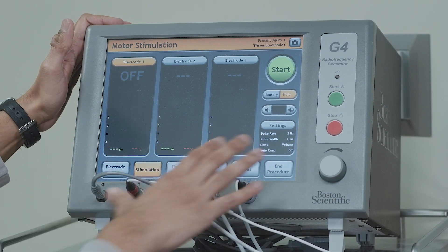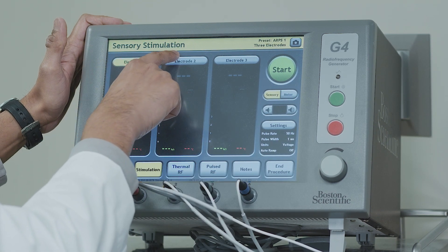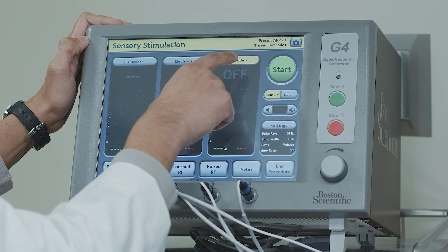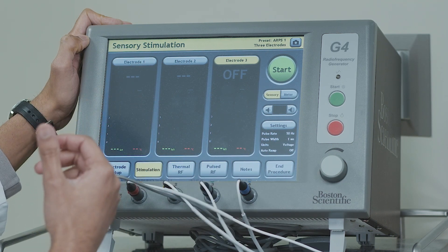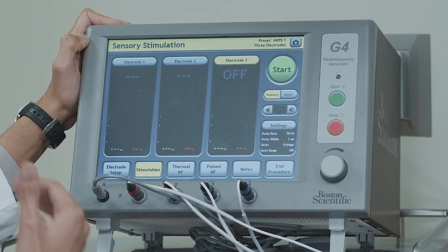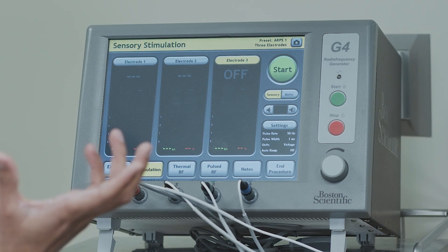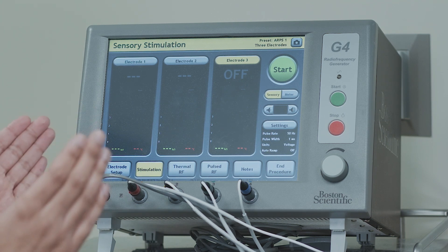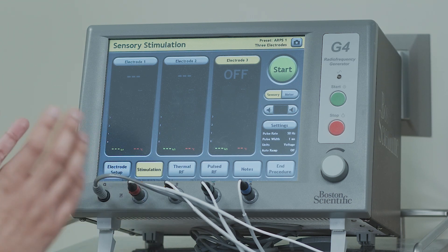Three needles are typically placed on each side of where the patient has pain. During sensory testing, each electrode corresponds to each needle in your body. We turn up the stimulation so you feel a pressure or tingle where the needle is. If you feel it below 0.5, that tells me I need less energy to get you to feel something, meaning the needle and nerve are close together — which is exactly what I want. If the number is too high, the needle and nerve are far apart and I need to make adjustments. That confirms the procedure will work.